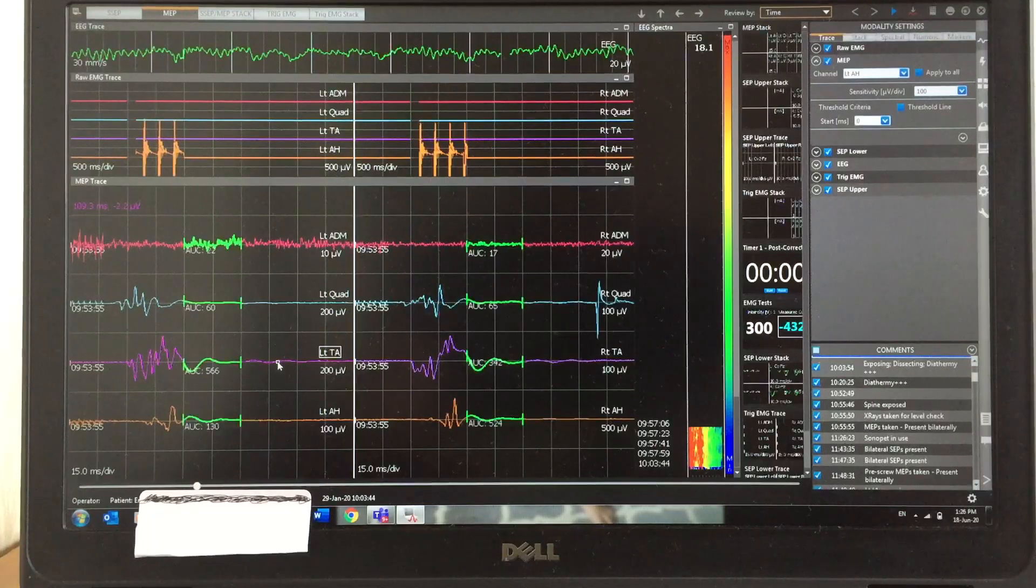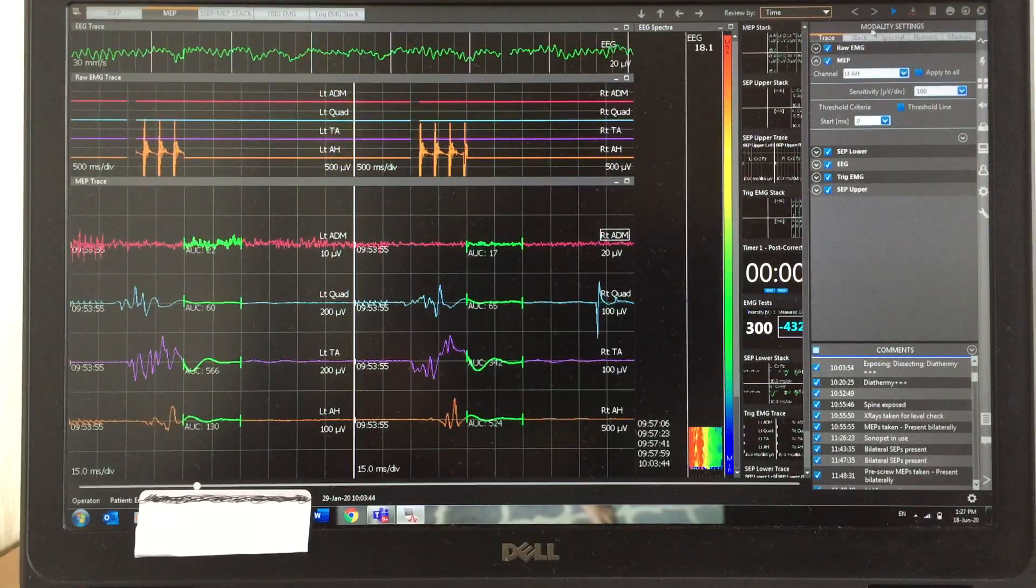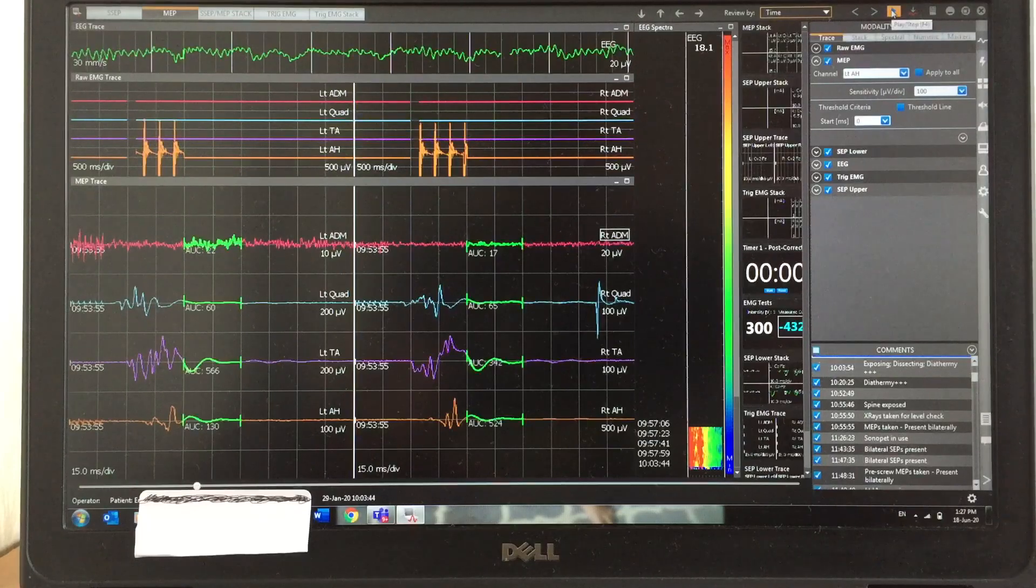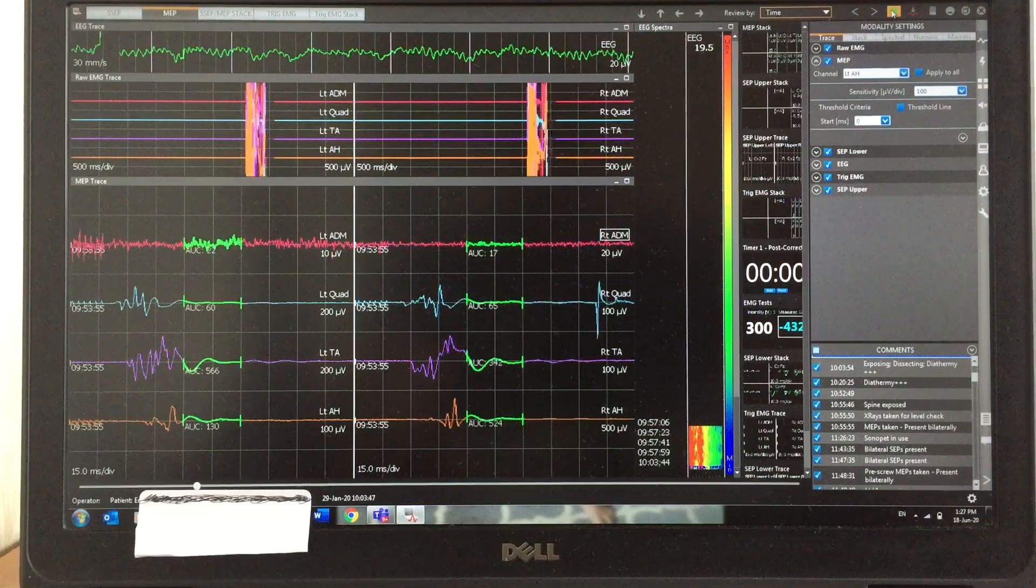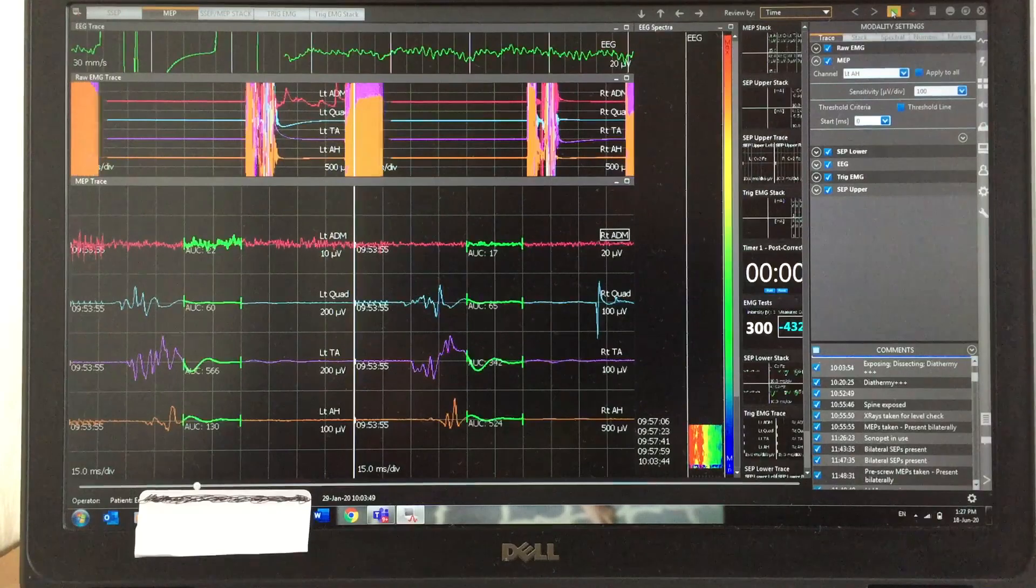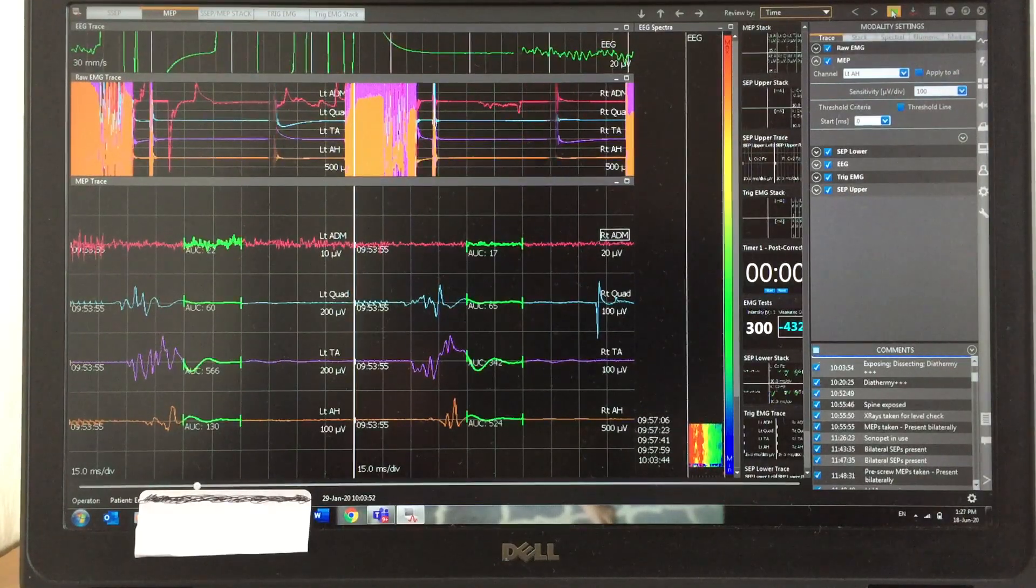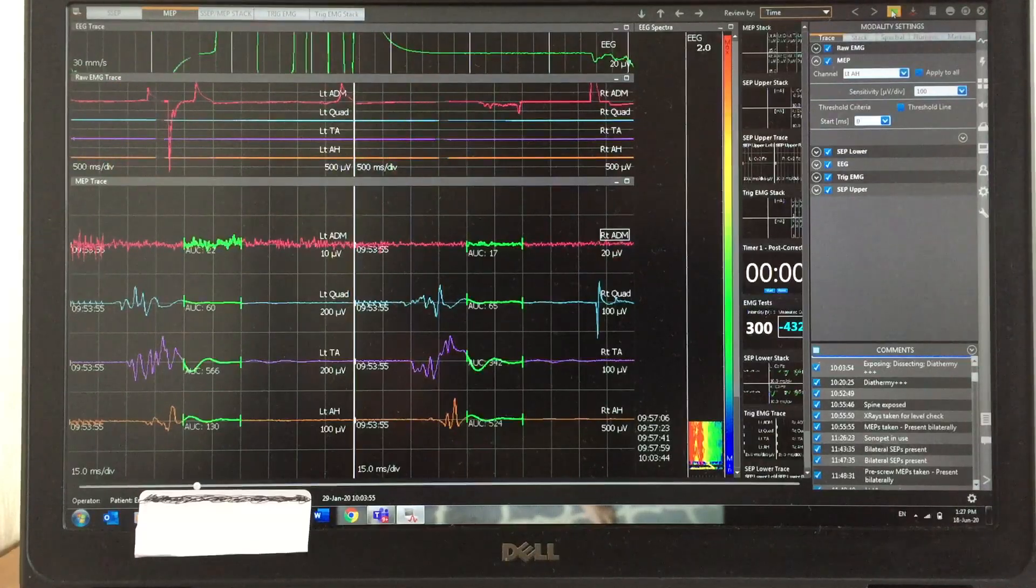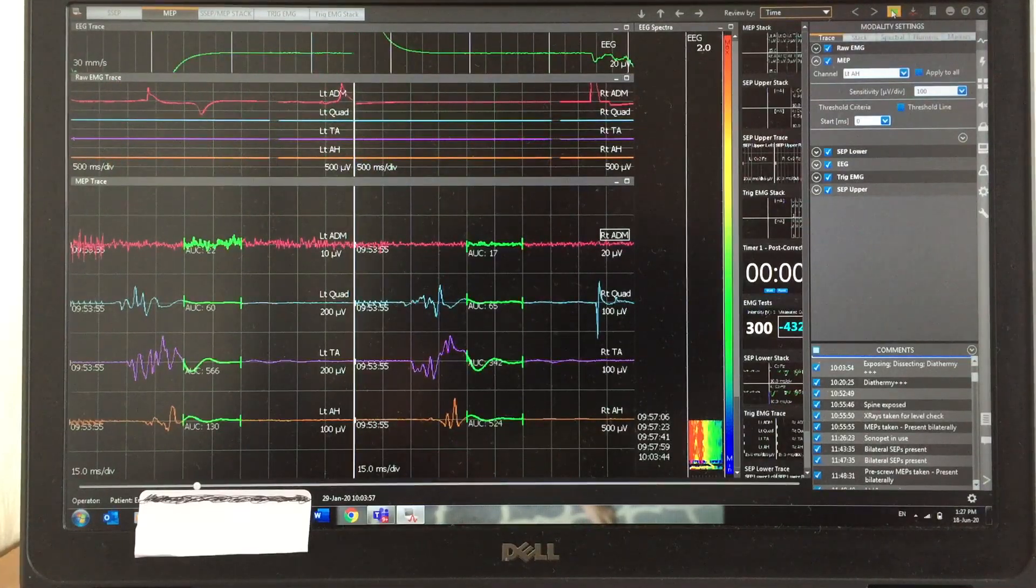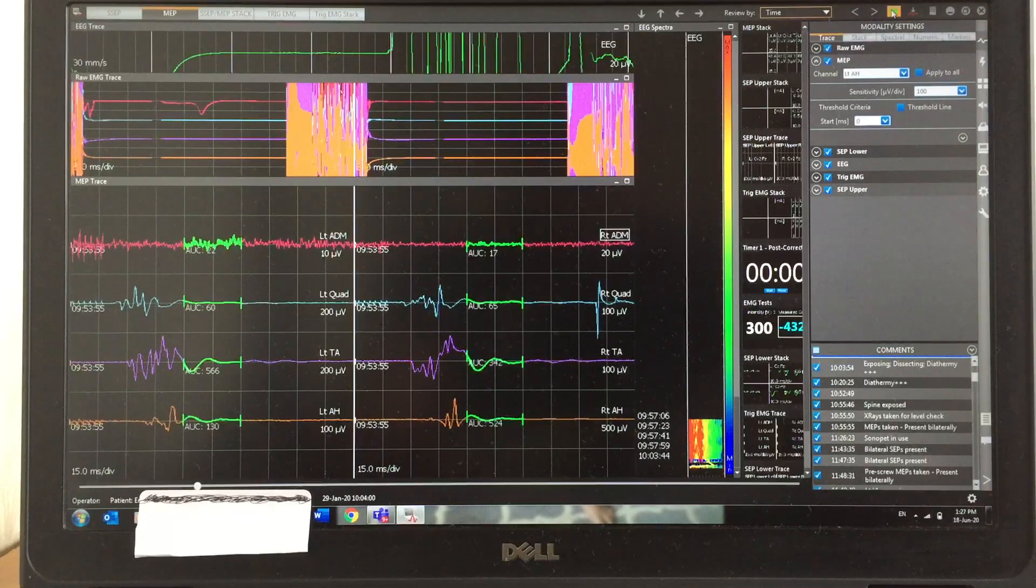It's always challenging sometimes, but not always. You can see very clearly the beautiful MEP responses and EMGs are very quiet. Now you can see quite a lot of EMG artifact, maybe due to diathermy.